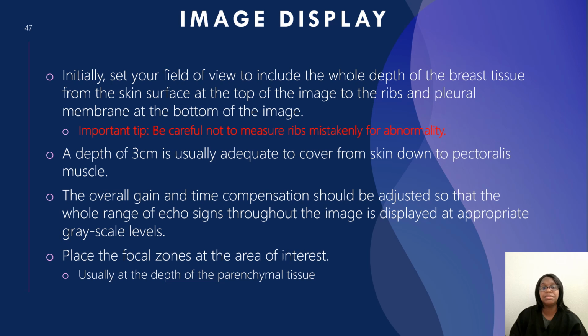So we like to be careful not to measure ribs whenever we are scanning. I know as a new technologist, it can be easy to mistakenly measure ribs, thinking that it is some type of pathology. So that's why it is important to know your anatomy.